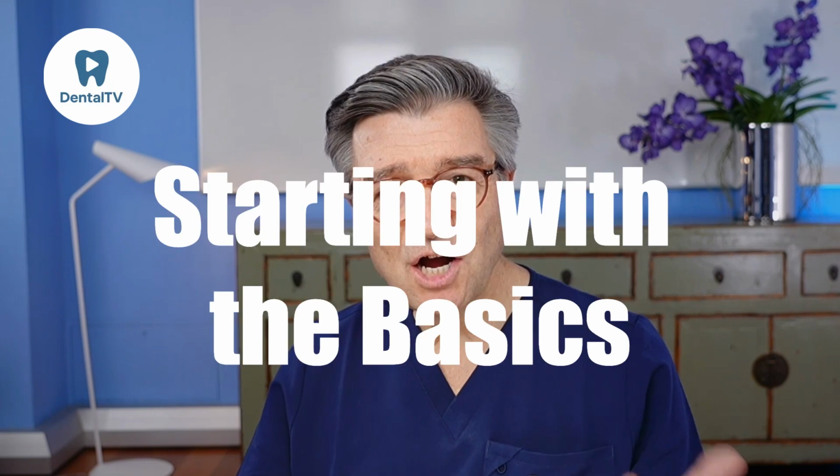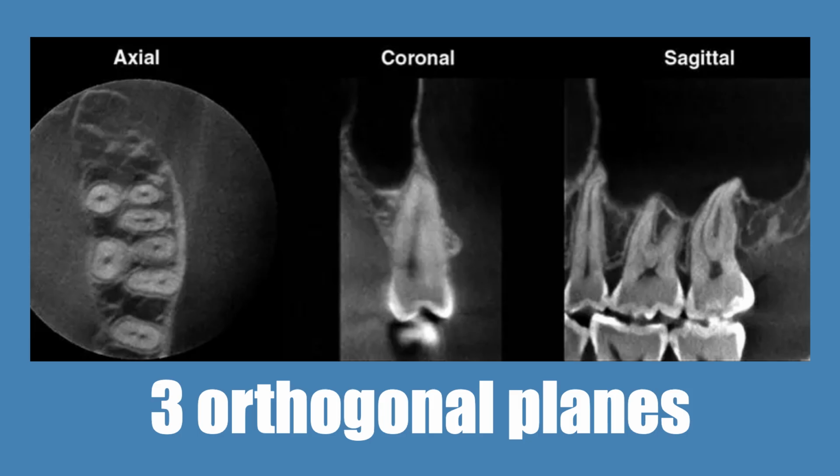But here's the reality. Most dentists learned how to adjust brightness and scroll through slices. Very few were taught how to evaluate the volume using a structured, repeatable protocol. And that is exactly what we will build today. Let's start with the basics. A CBCT volume is organized into three orthogonal planes: axial, coronal, and sagittal. Every diagnostic conclusion depends on navigating these planes with purpose rather than random scrolling.